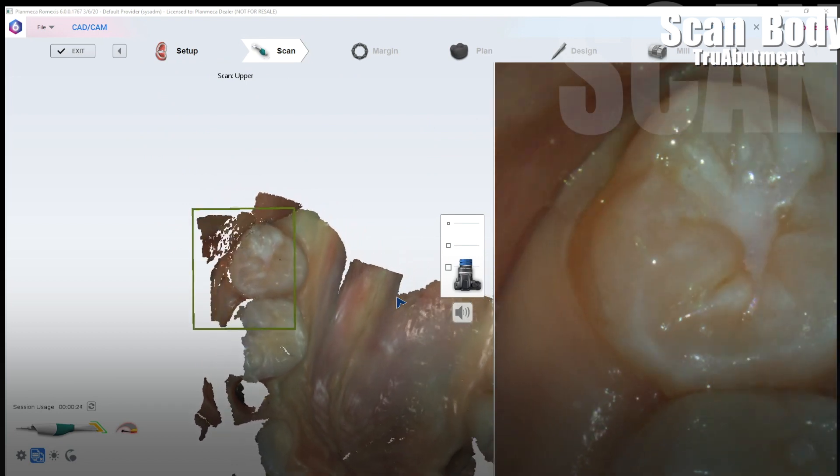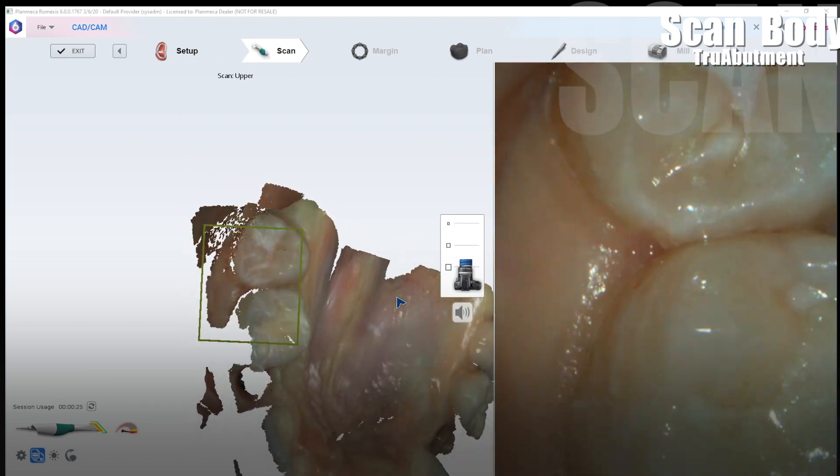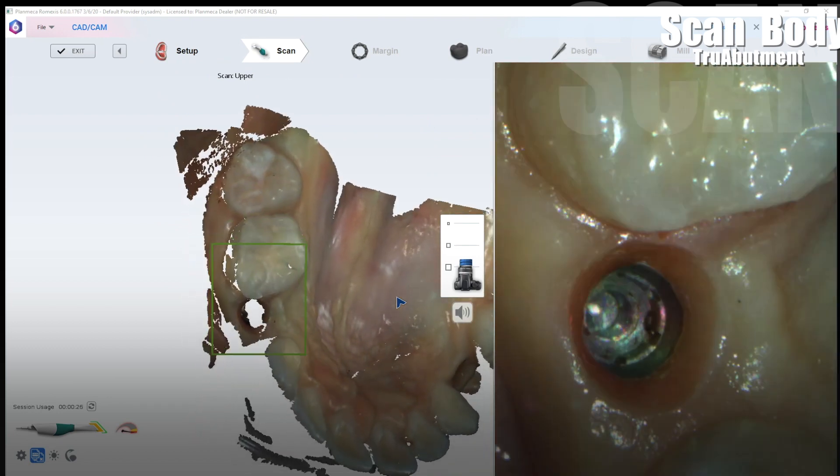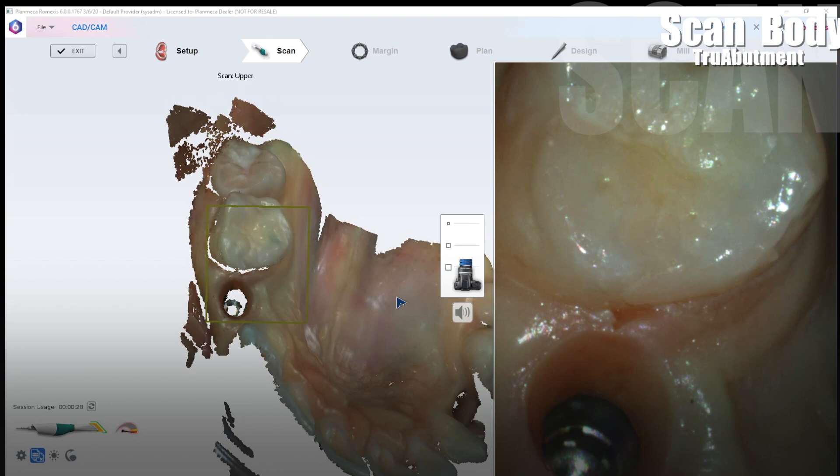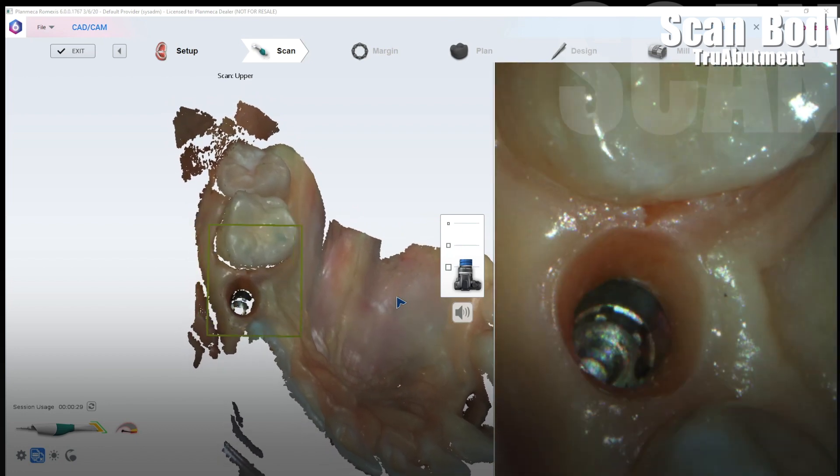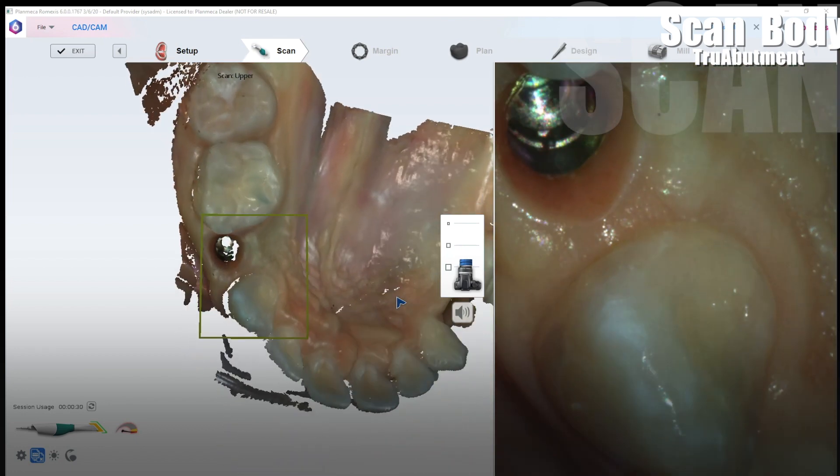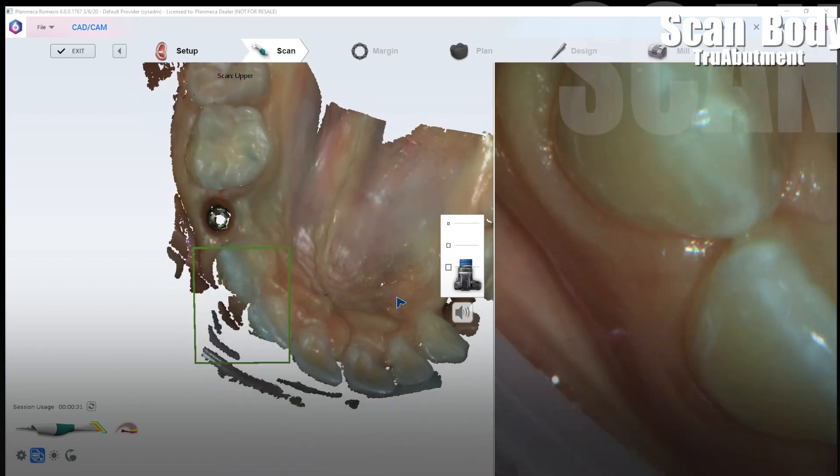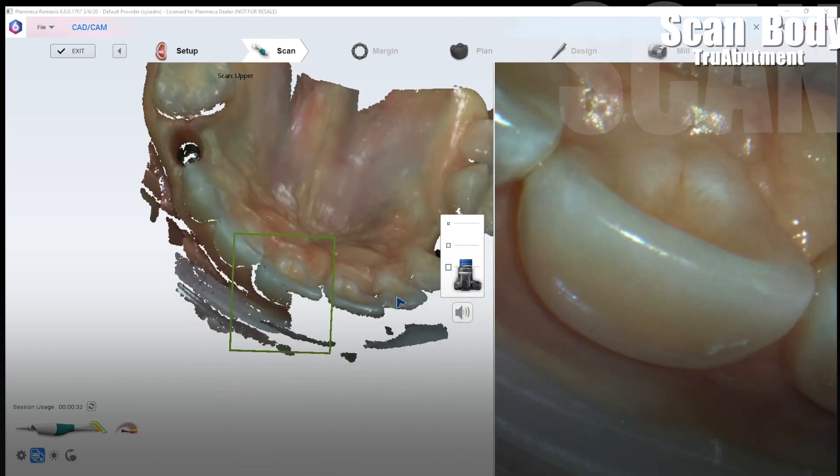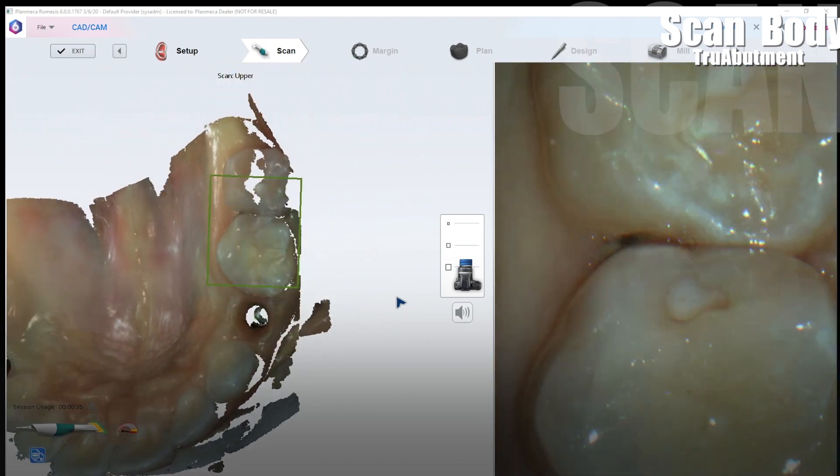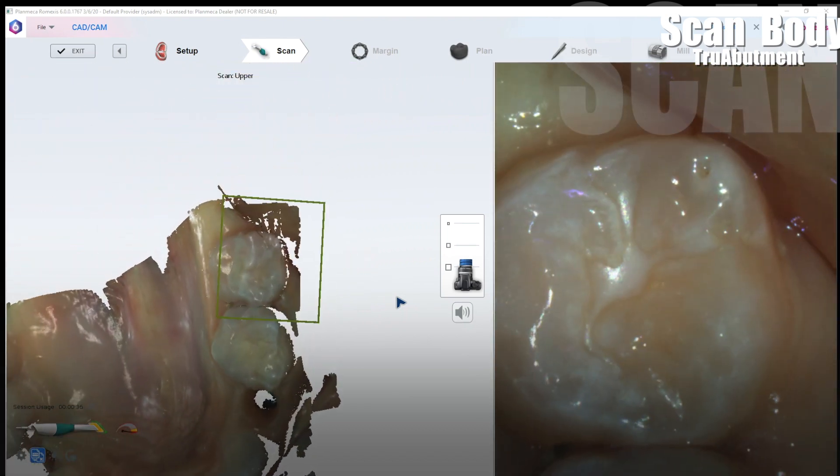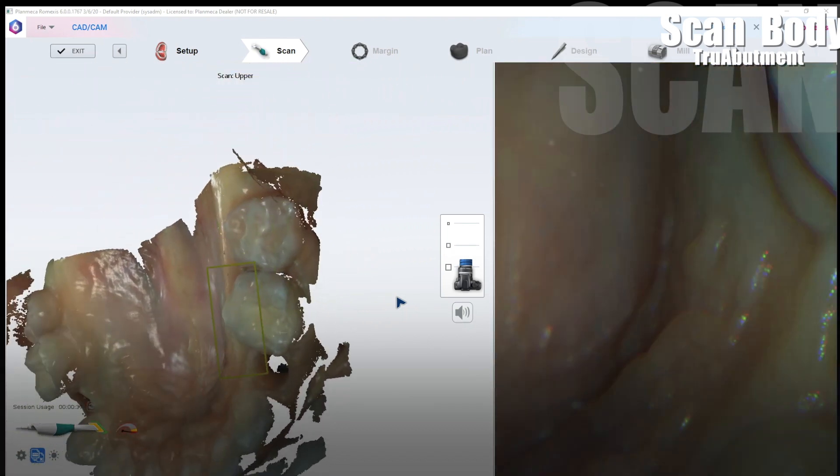Now I'm going to start to get the buccal and very slowly rotating to the buccal at about a 45 degree angle here. Always keeping some of the lingual in view. Okay splitting the difference there. Super easy.